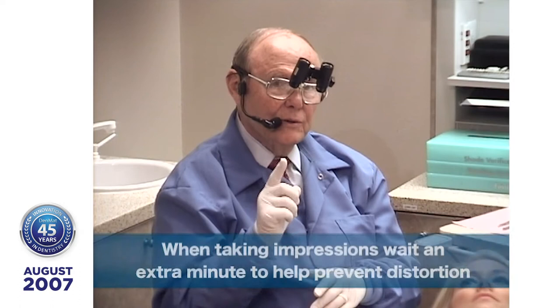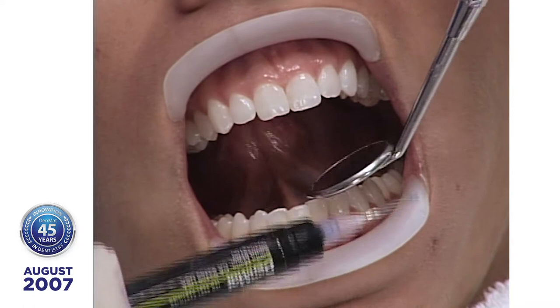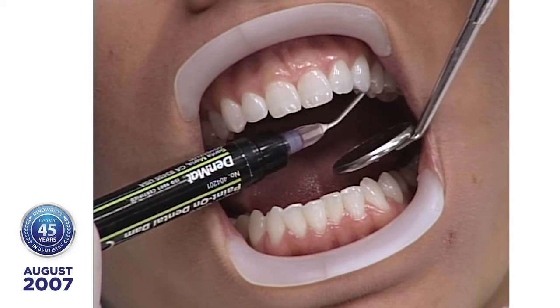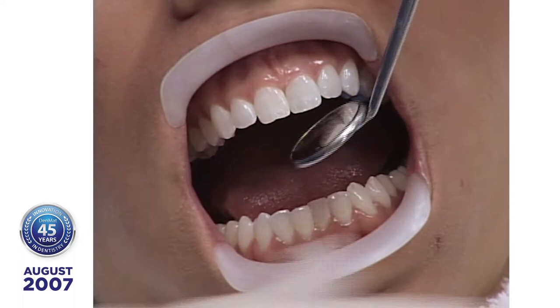Jessica has already polished the teeth with porcelain polishing paste. The reason we do that is it contains an enzyme — papain — to break up the proteogenous material called plaque. The first thing we're going to do is put some paint-on dental dam on the lingual side of the teeth. It's the same thing you use when doing chairside bleaching. Wherever I put the paint-on dental dam, the ultrabond and the tenure won't adhere. Give it a three-second burst — first, close your eyes. The best way to protect your eyes is to close them.